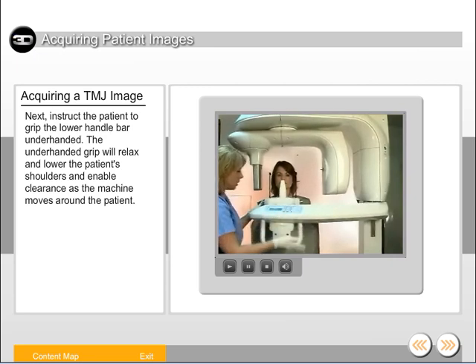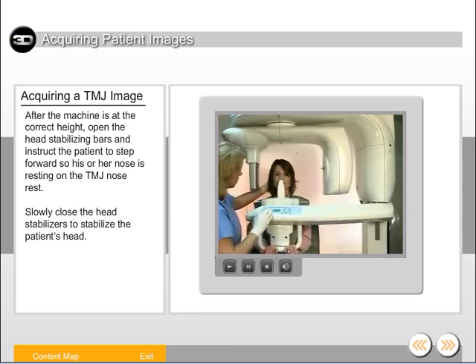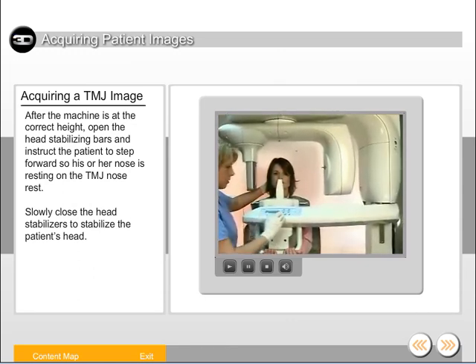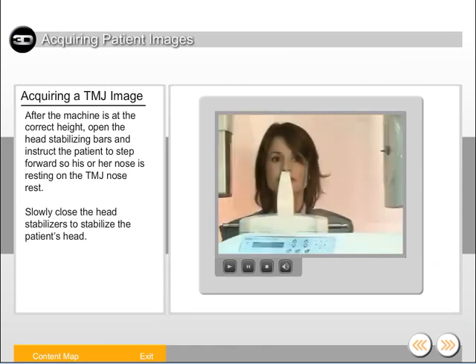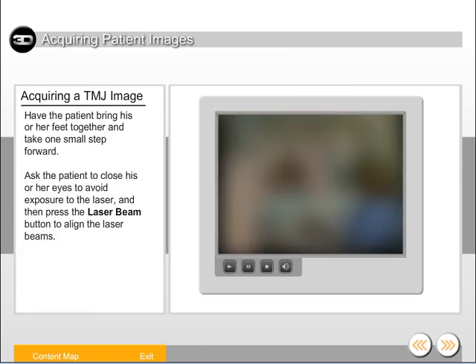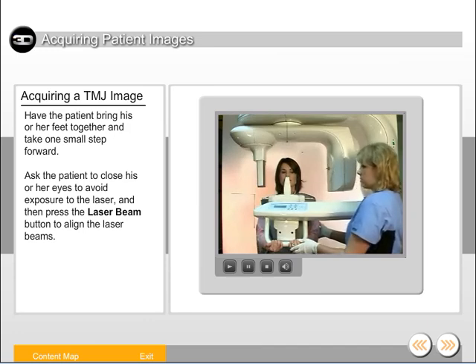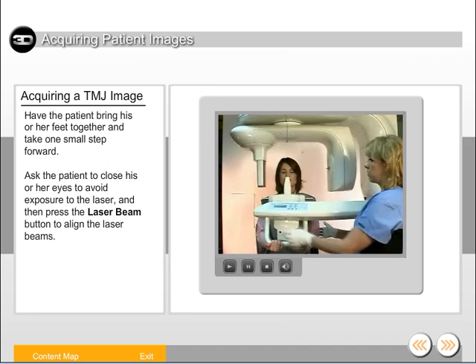Instruct the patient to grip the lower handlebar underhanded. The underhanded grip will relax and lower the patient's shoulders and enable clearance as the machine moves around the patient. After the machine is at the correct height, open the head stabilizing bars and instruct the patient to step forward so his or her nose is resting on the TMJ nose rest. Slowly close the head stabilizers to stabilize the patient's head. Have the patient bring his or her feet together and take one small step forward. Ask the patient to close his or her eyes to avoid exposure to the laser, then press the laser beam button to align the laser beams.